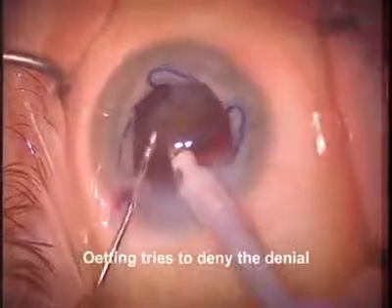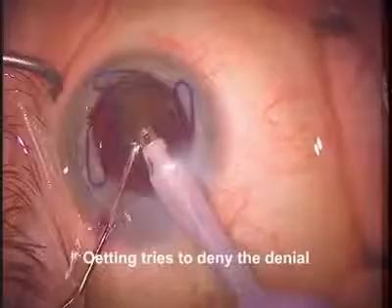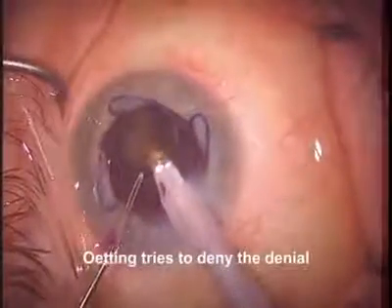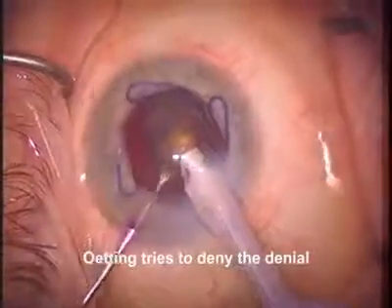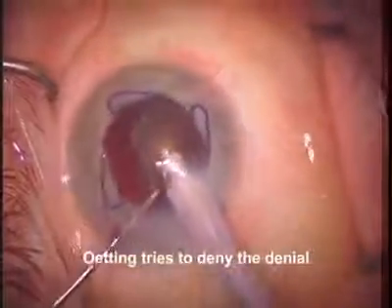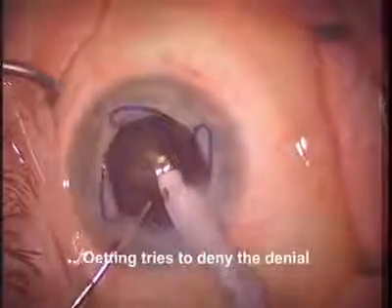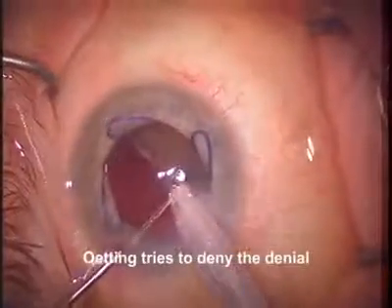But you can see I'm really in denial now. It looks very loose. There's even a piece, in retrospect, that you can see that's floating posteriorly to the lens. But I'm still pressing on, and I really haven't yet detected any problems. But I'm in the denial phase, where I'm feeling like something's wrong, something doesn't seem right. And of course we've been in that mode for a while.